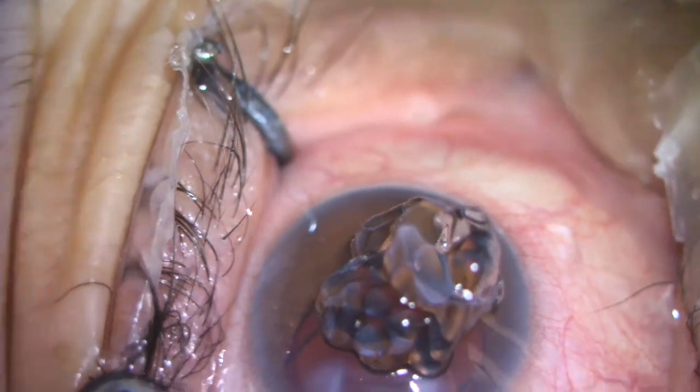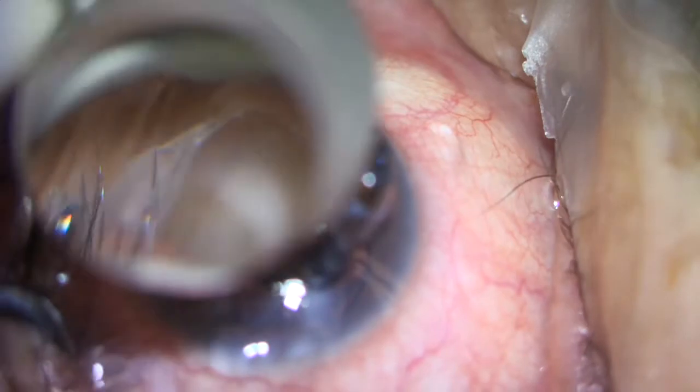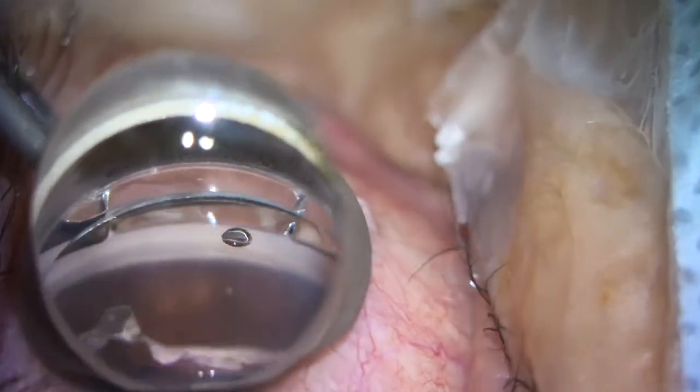I place some additional GV on the cornea and use my gonio prism to visualize the angle. The patient's head has been turned away from me. You'll see I'm focusing in on the angle. This is a fairly darkly pigmented eye. Visualization of the angle in this patient is not great. However, I am able to see the trabecular meshwork and the scleral spur. She does have some anterior synechiae, which limits the view somewhat.